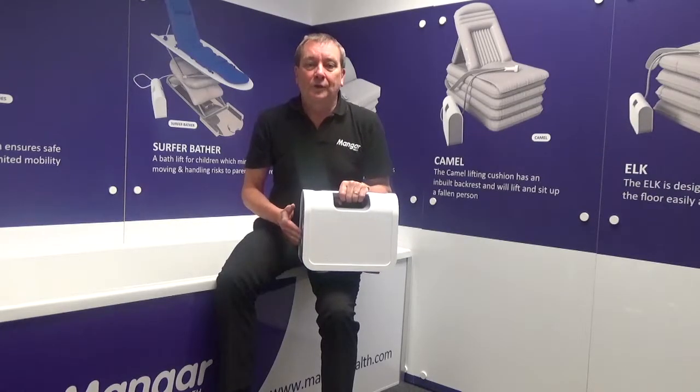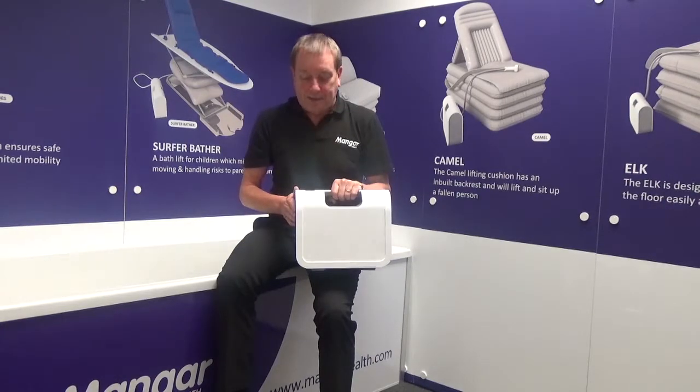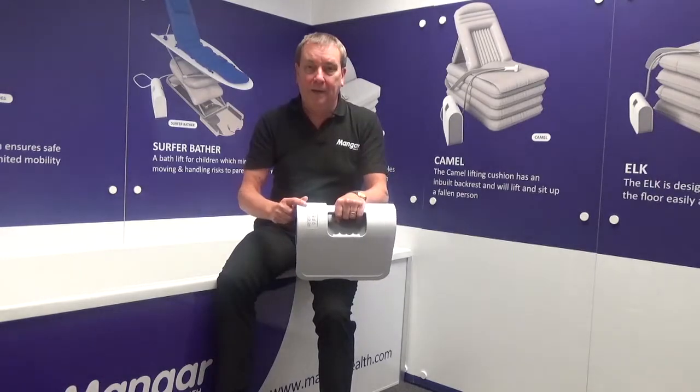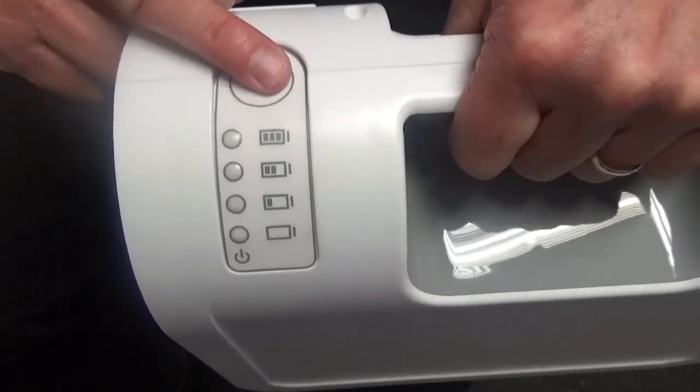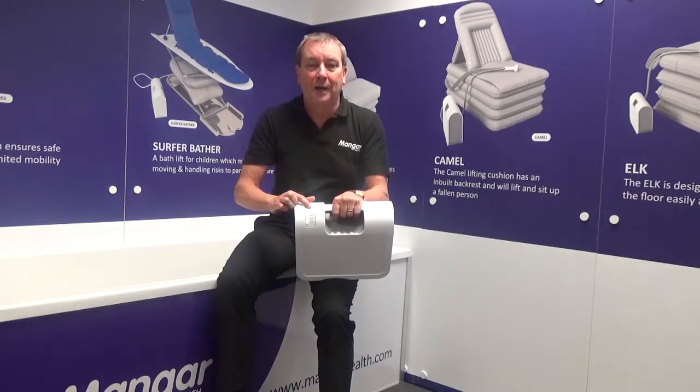In this session we want to look at the Airflow 24 compressor which is supplied by Mangar for our Elk and Camel lifting cushions. The first thing to point out is that we do have a battery indicator on the top here. If I push the button you'll notice at this stage all four lights come on, which tell me that this battery is fully charged.